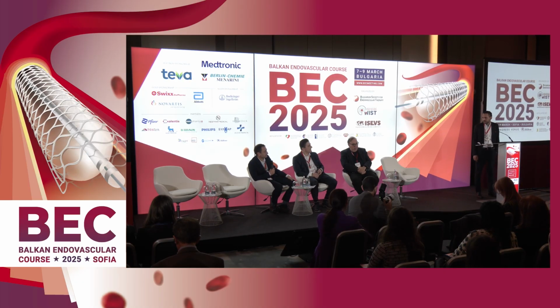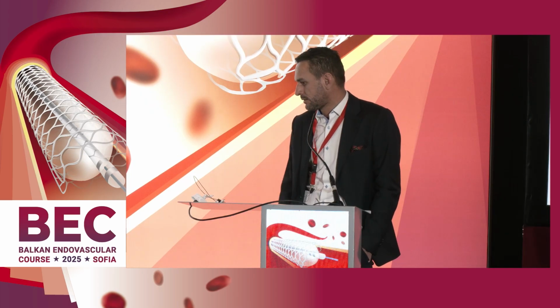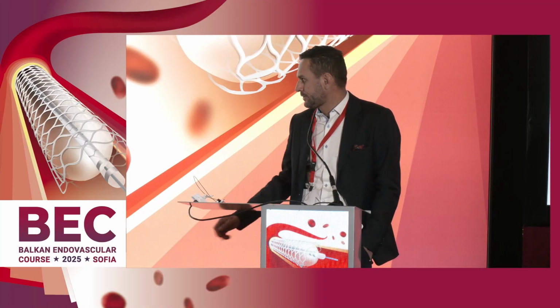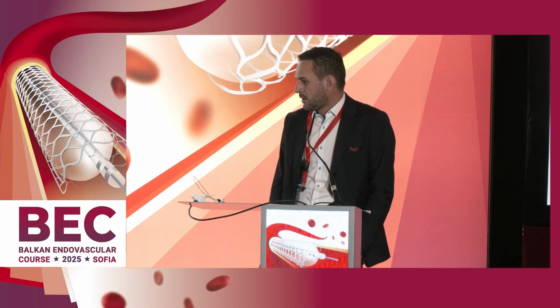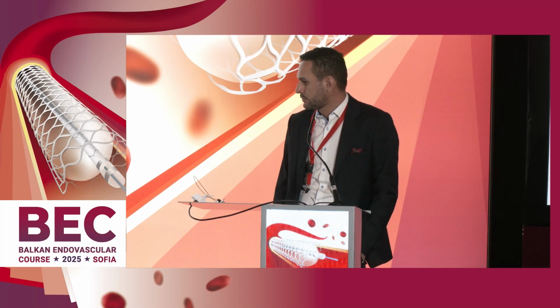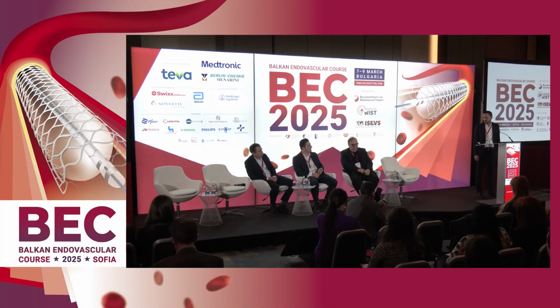Only 5 French. Okay. And if it is necessary to put a stent in the lesion, we use the Supera or Everflex. It's compatible with 5 French, yes. Supera sheathless. We use it now, and for the iliac intervention, the tibial approach, in 5 patients this year. Okay, thank you.